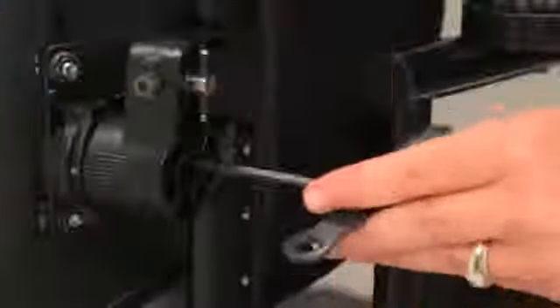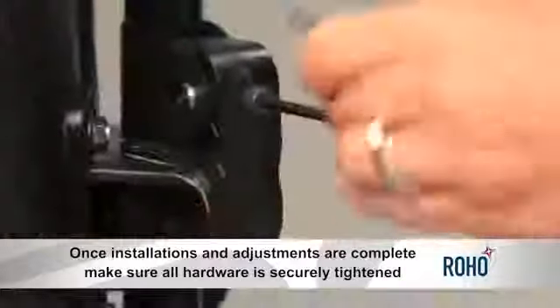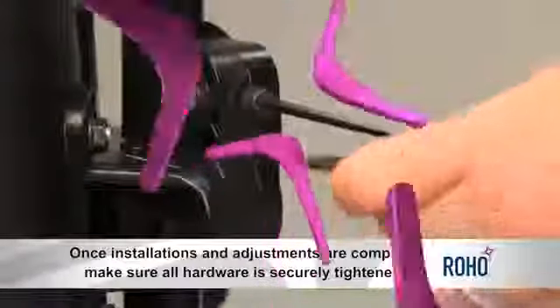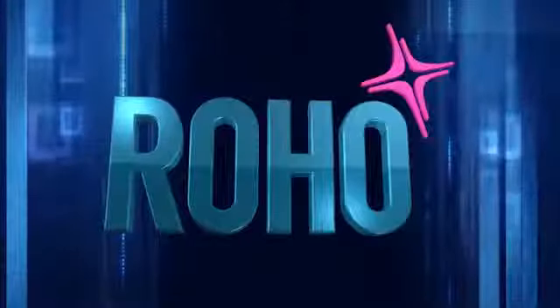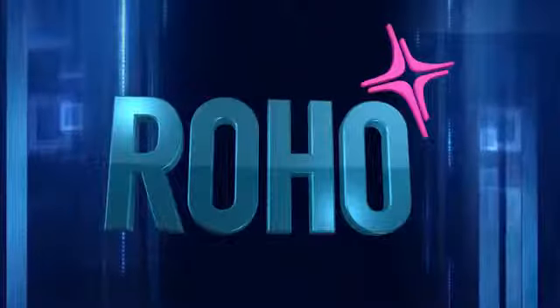Once depth and angle adjustments have been made, tighten right and left depth and angle adjustment bolts with the Allen wrench until snug, plus a quarter turn. This completes your height, depth, and angle adjustments for the Agility fixed hardware. Once installation and adjustments are complete, make sure all hardware is securely tightened. ROHO Agility back systems are the perfect blend of innovative features, giving wheelchair users comfortable support without sacrificing function.